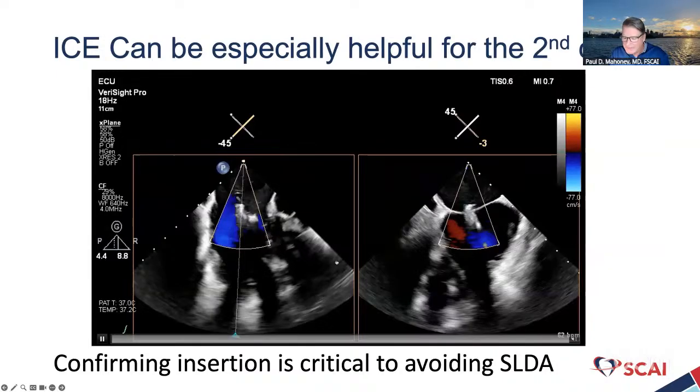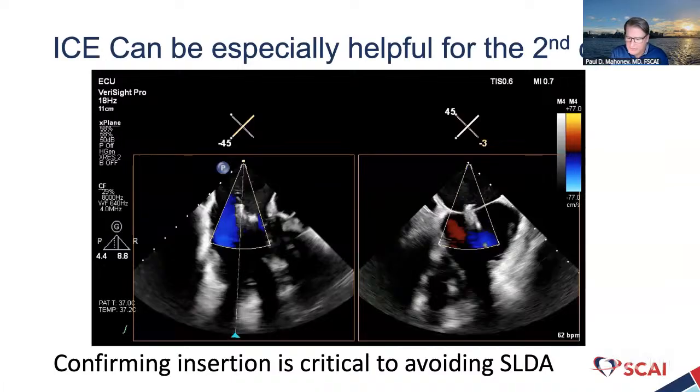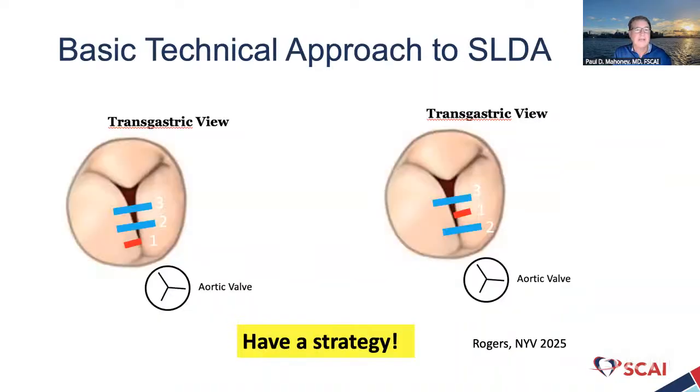And it's especially helpful on multiple clips because the first clip also will shadow the second clip. So with the second clip, you can isolate that clip with ICE. You can see the leaflets going in. You can make sure you have adequate grasp and you feel confident letting it go, because very often the SLDA is the second clip, not the first one.